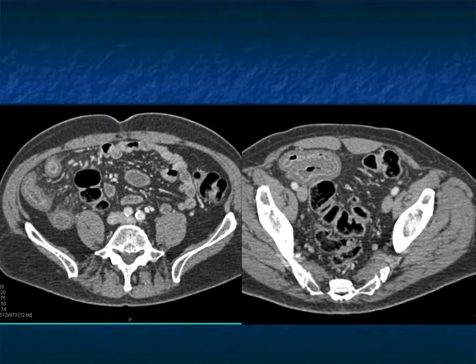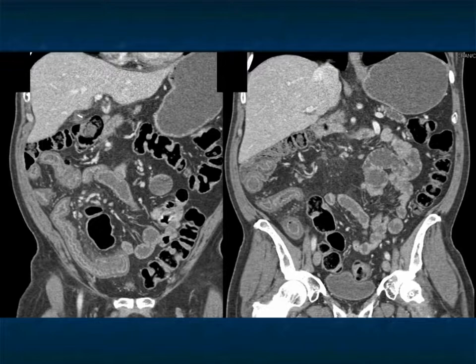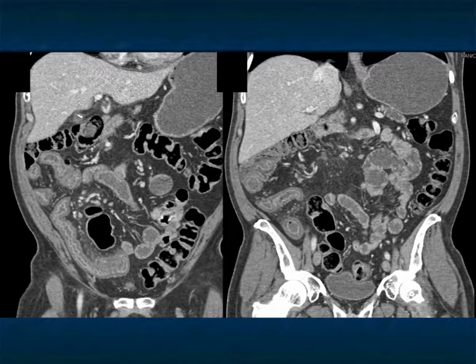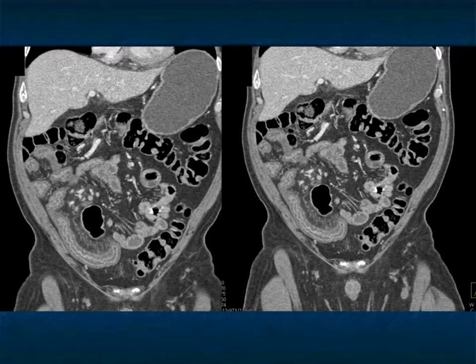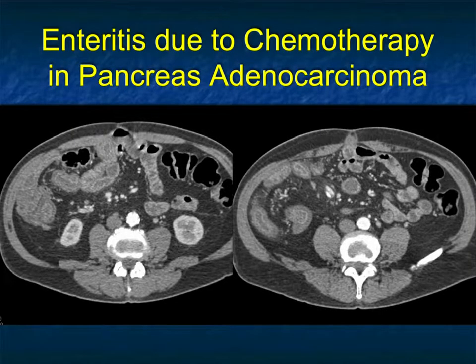Interestingly, sometimes patients have abdominal pain and CT findings to match, but sometimes patients on routine follow-up have very impressive bowel disease on CT without symptoms. Look at the extent of distal involvement in this case — with the right history you might think ischemia or graft-versus-host disease, but this was enteritis due to combination chemotherapy with oxaliplatin-FOLFOX in this patient.